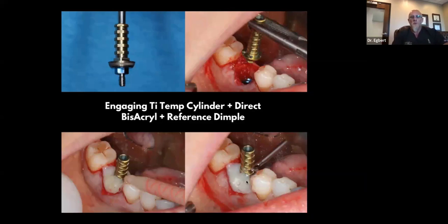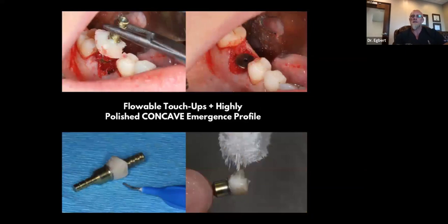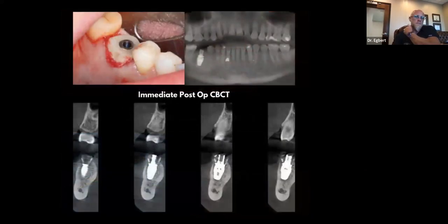So this is important. I can't tell you how many times we've made these. After a while, you should be able to fabricate these in 10 to 15 minutes max. You're definitely going to want to charge out a 6051 temporary abutment, 6085 temporary crown that's cut off at the top. But long story short is, if you don't put some sort of index so you know which way it goes, you're going to have a heck of a time getting that in. So you'll notice this little dimple that we put over here on this side, so we know that's to the buccal. By the time we take that out, we can trim it, we can polish it.